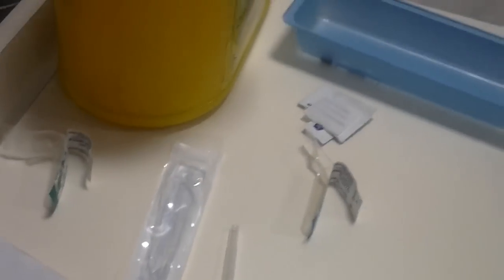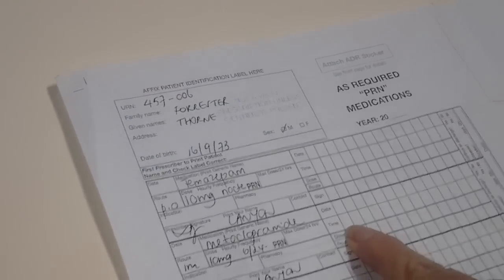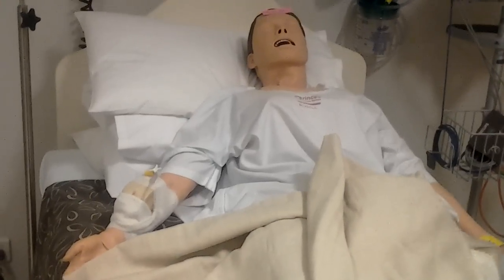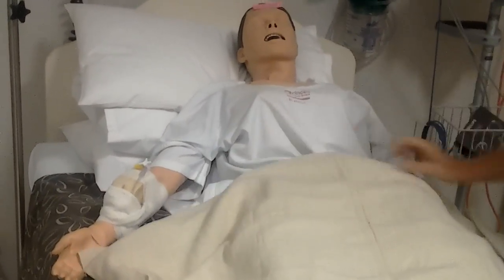Document the procedure on the patient notes, the time, dose, and your signature and the signature of the RN. Wash your hands and return to check the patient response. And he looks very comfortable with no nausea or vomiting. This is the conclusion of an intramuscular injection.